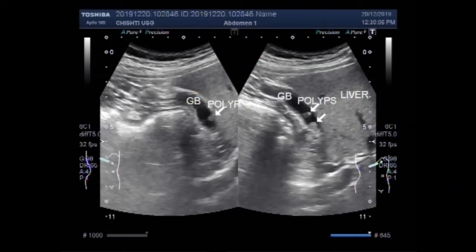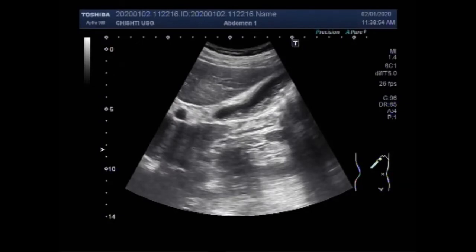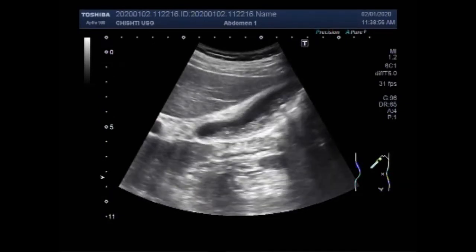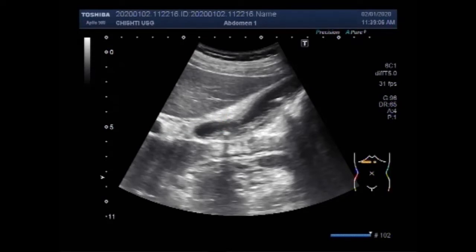Now you are going to see the second video, which shows multiple small stones, sand particles, and thick sludge in the gallbladder — in fact throughout the whole length of the gallbladder.